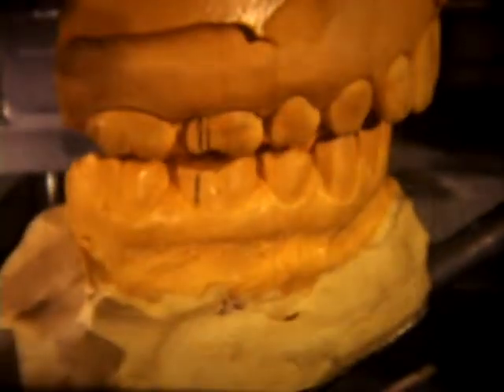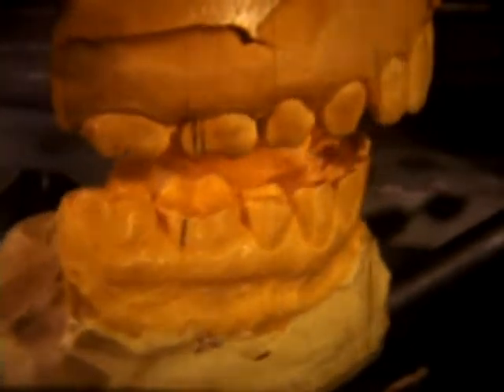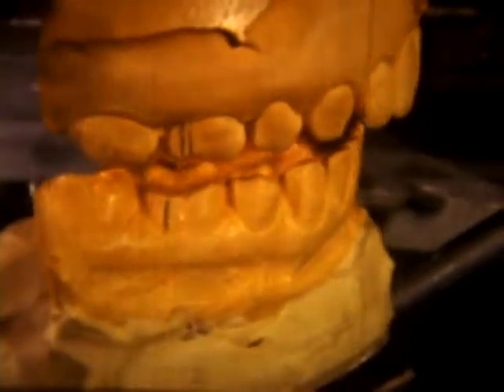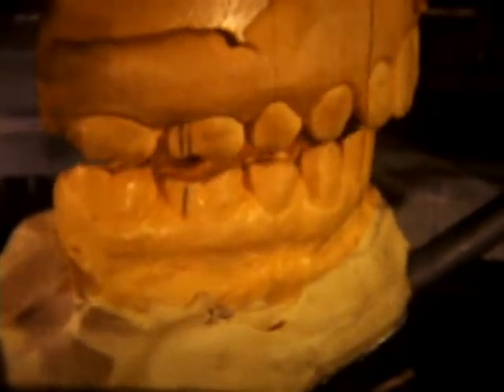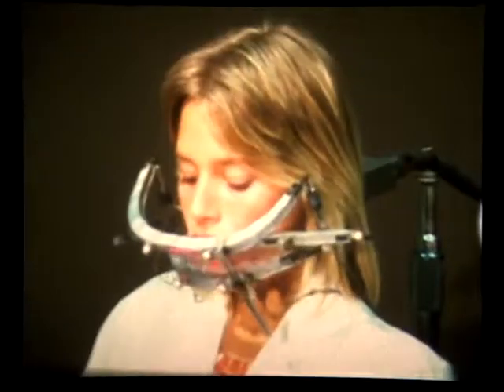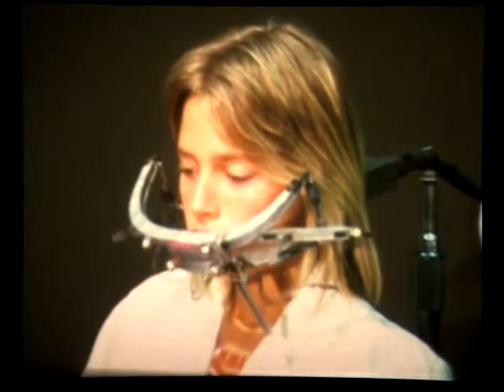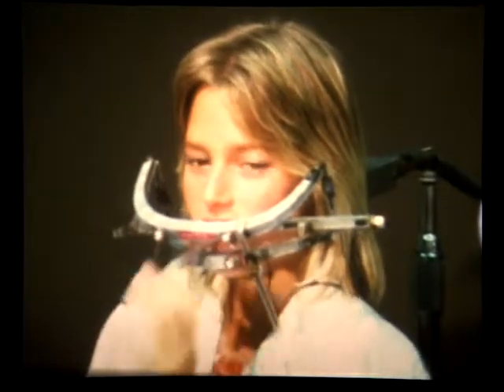This subject's slow motion chewing series demonstrates typical wide lateral working side opening strokes and then a posterior turnaround, bringing the closing molars upward and forward to their starting position. Here, the subject, whose casts were just shown, uses the occlusal index that gives the computer a 0 starting and ending point for each chewing series.